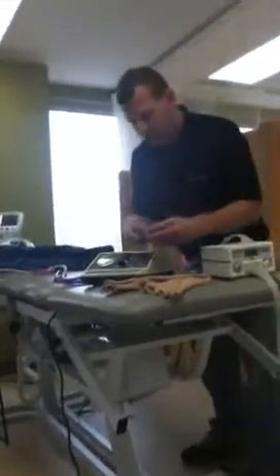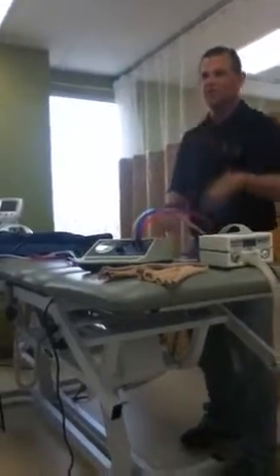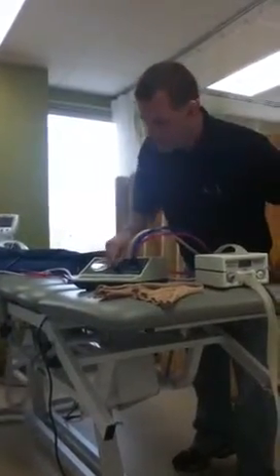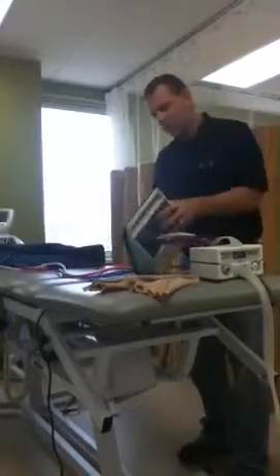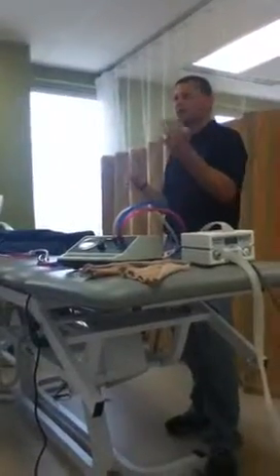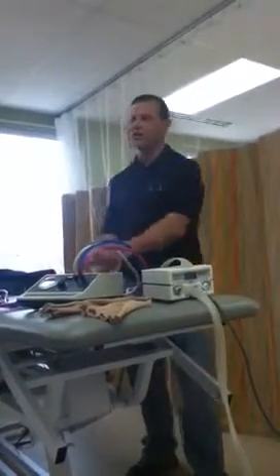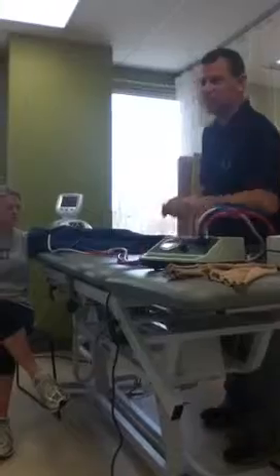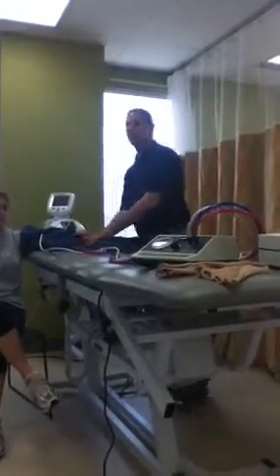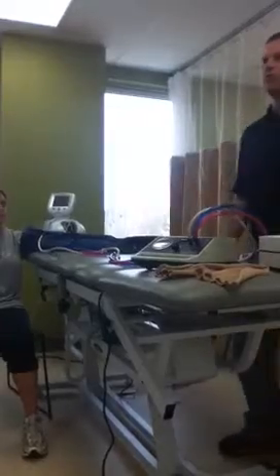I might have to put some pillows under it and try to make her comfortable. If she's really going to be on this for a long time, she may want to lay down and prop her arm up. If I've got it on a leg, I'm propping that leg up. Your book talks about on times and off times — if it's lymphedema it may be one setting, if it's venous stasis it may be another. This machine doesn't give you that control, so you may have to read your owner's manual. It's going to pump up the first chamber until it gets to the set pressure, then pump the next one, then the next, then release and start over.